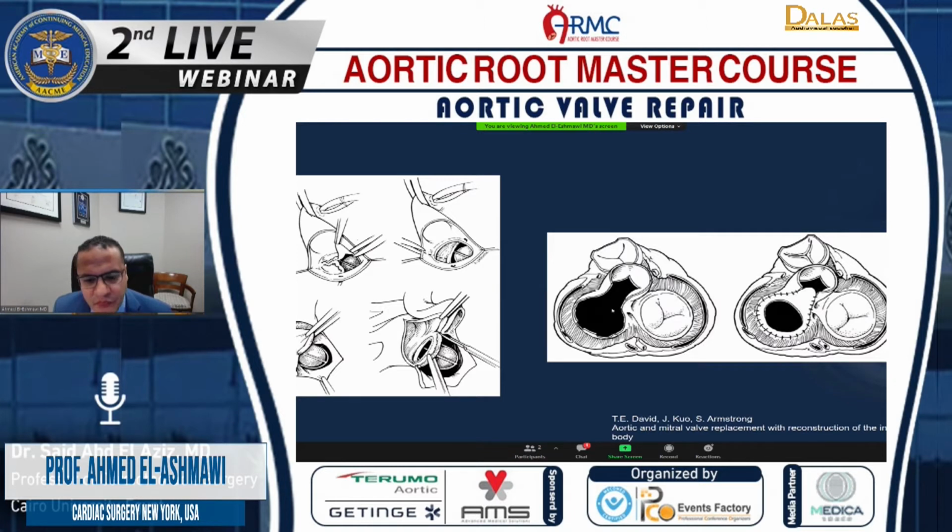You can imagine from this approach, we can definitely enlarge the mitral annulus by at least a third of the circumference. At the same time, you can enlarge the aortic root. So it is a great procedure to address patient prosthesis mismatch or patients who have destruction of the curtain due to whatever pathology, as I'm going to summarize at the end. So we'll go to the video.